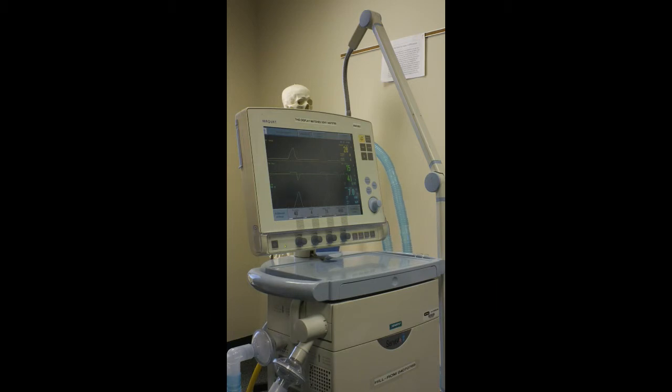Plateau pressure is a direct reflection of the pressure needed to keep the alveoli distended. So you do the inspiratory hold. Yes, you do an inspiratory hold. Say that one more time. Plateau pressure is a direct reflection of the pressure needed to keep the alveoli open and distended. It's a very important number on our ventilator.